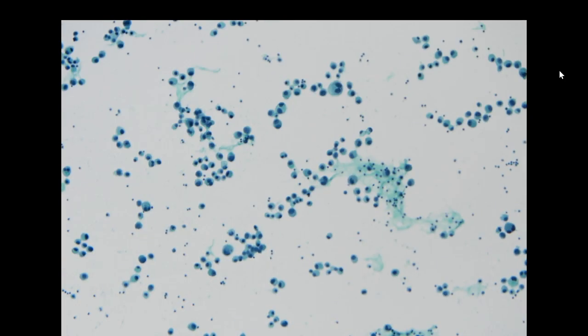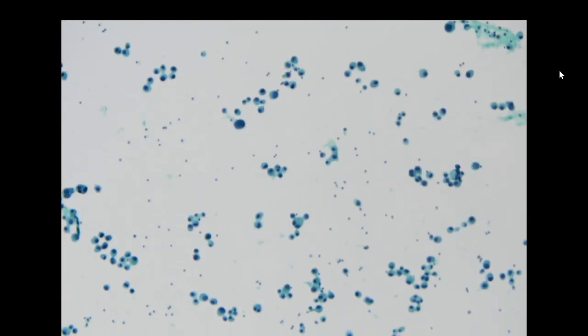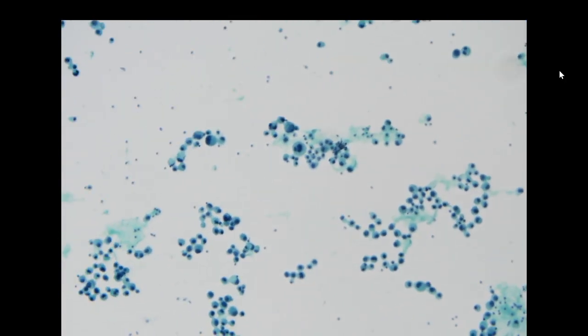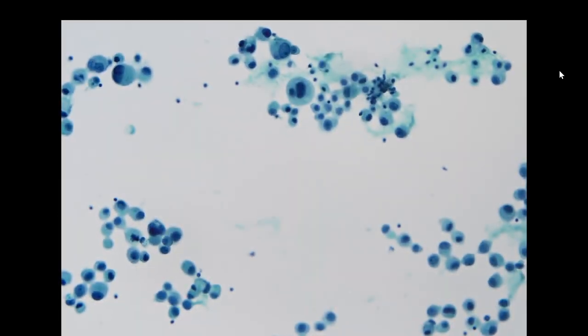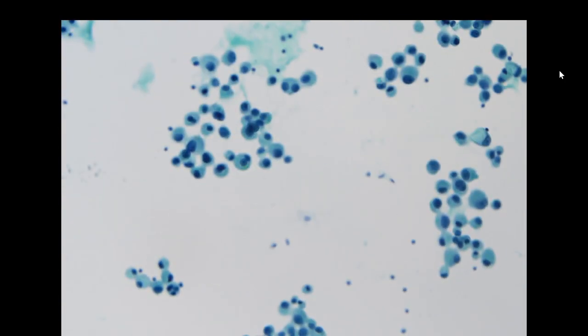So in this poorly differentiated scenario, sometimes the so-called two-cell population is basically a spectrum, and it is very difficult to be certain within the middle of the spectrum whether it is metastasis or reactive. But what we do is just search for the end of the spectrum, the most high-grade, the most diagnostic cell, and then we can make our diagnosis.